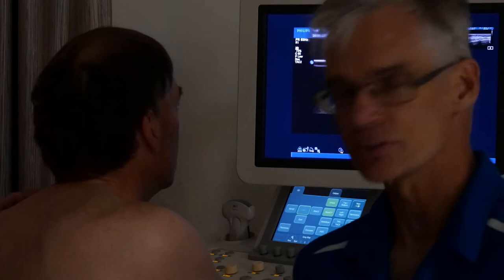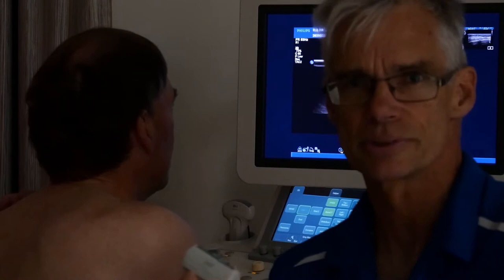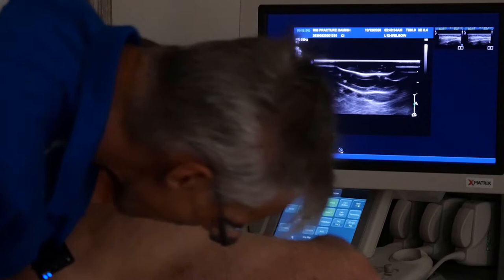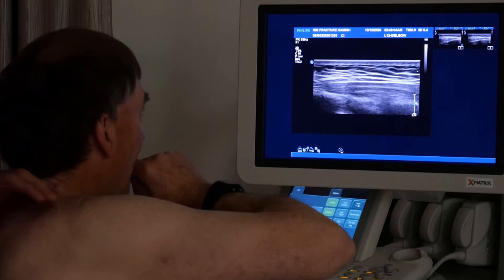They'll point to the fracture - it's much easier than looking at an x-ray where you don't really have that guidance. The patient will put your finger on it and say 'that's where it is,' and you put your probe exactly there. The key is to get used to following ribs around their curve. Just show me where it's sore... okay, got that, so we just pop the probe on there.